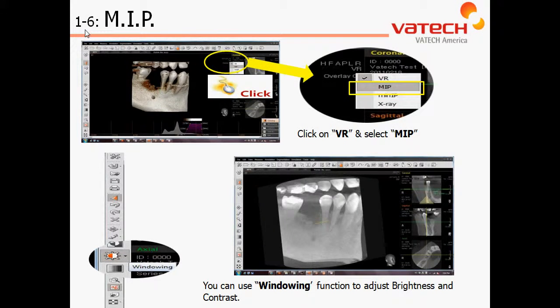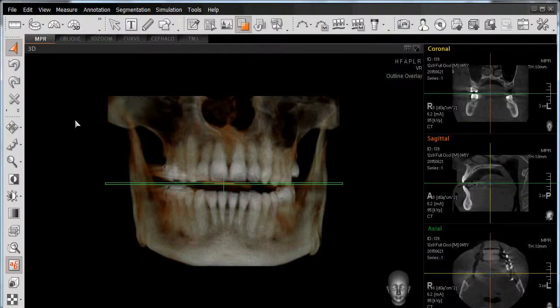Chapter 1, Section 6: Maximum Intensity Projection, or MIP View. To demonstrate the functionality of the Maximum Intensity Projection, or MIP, we'll continue working with our 3D rendering.